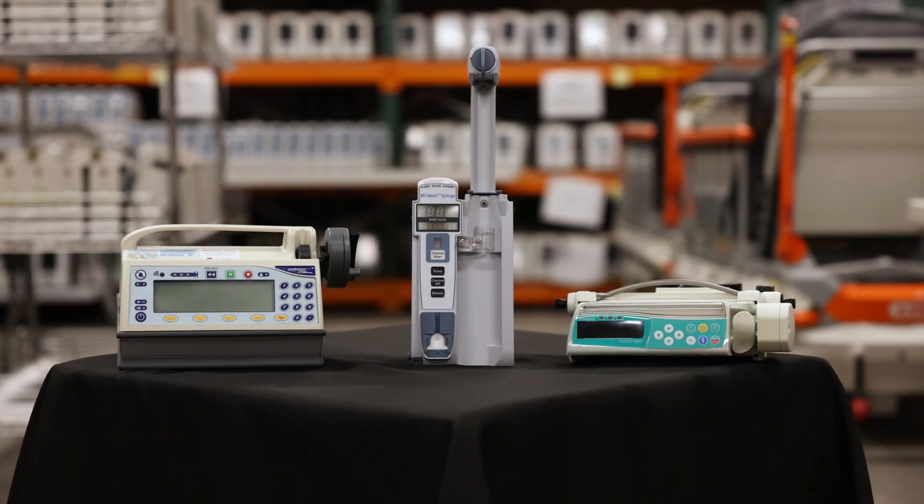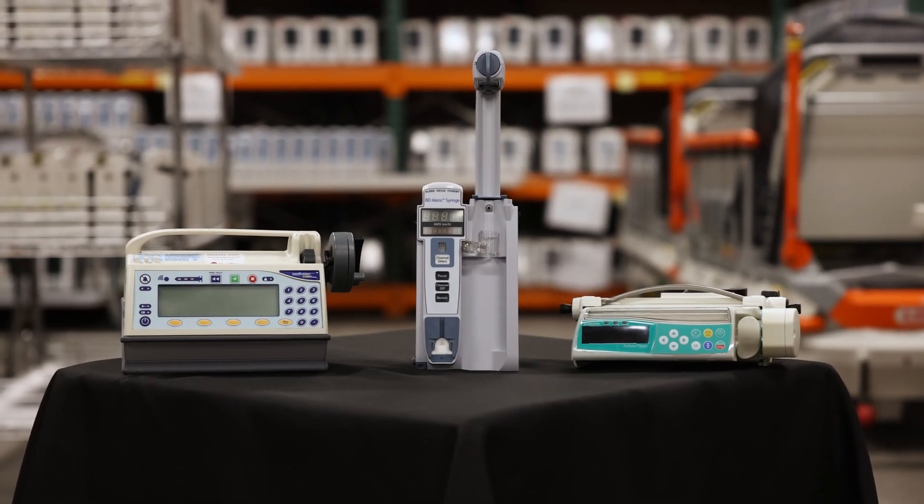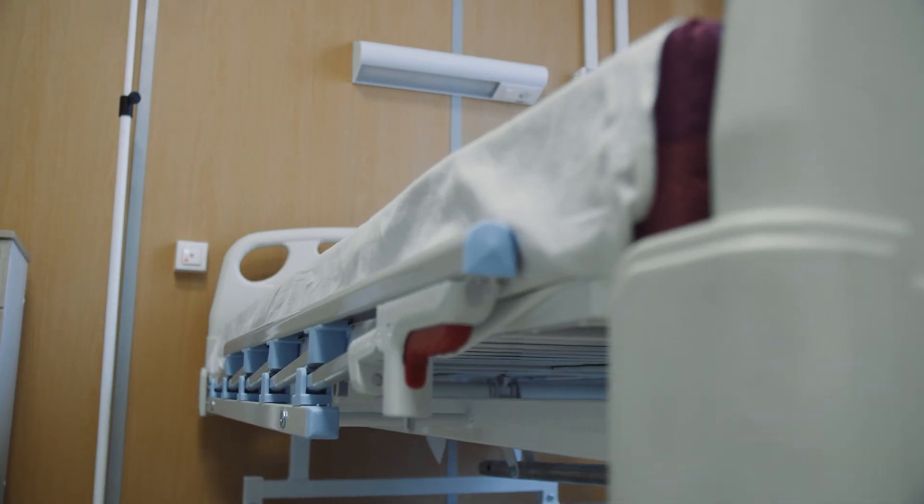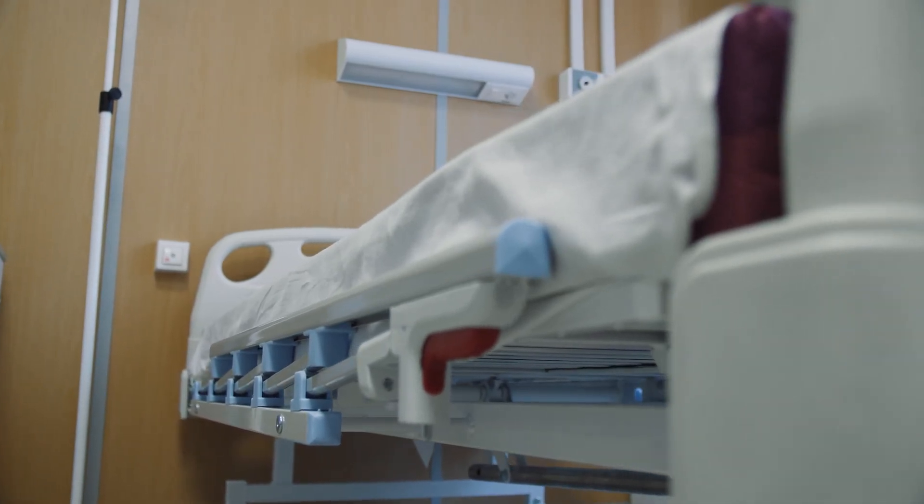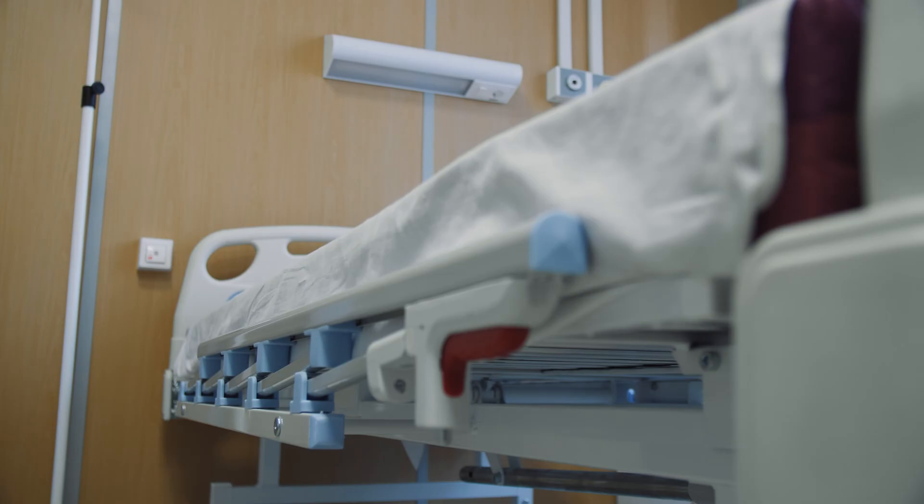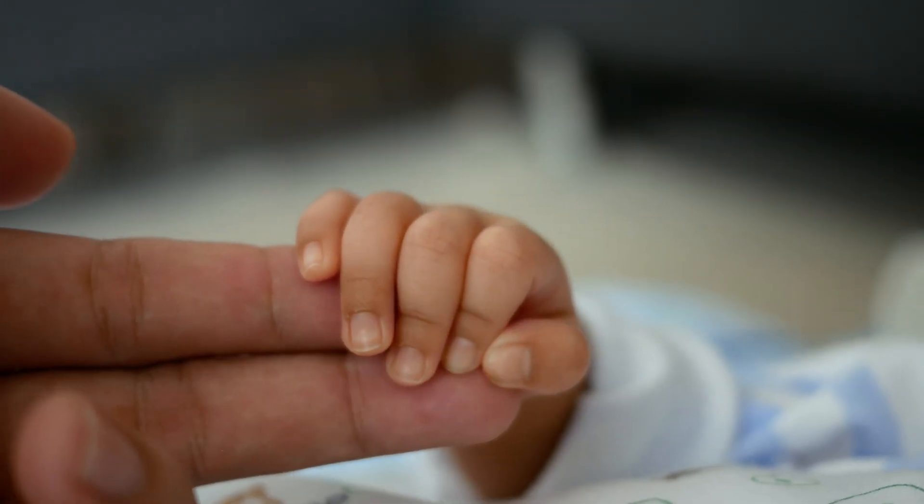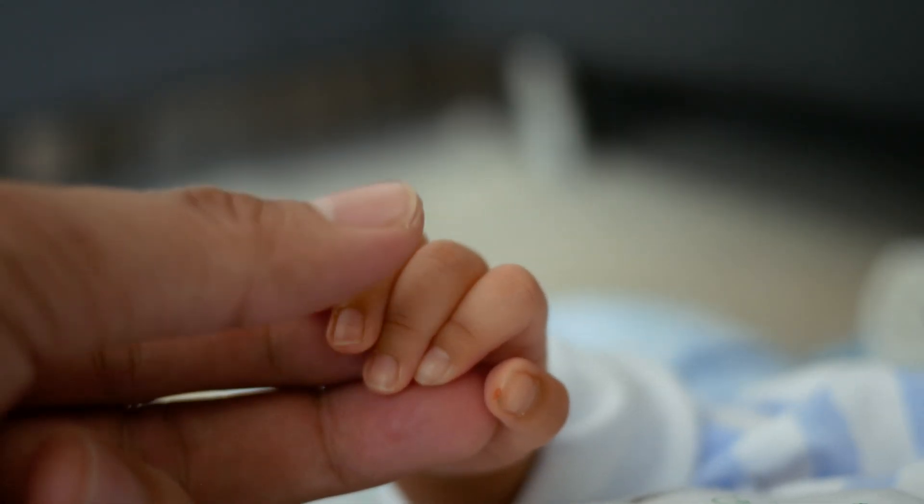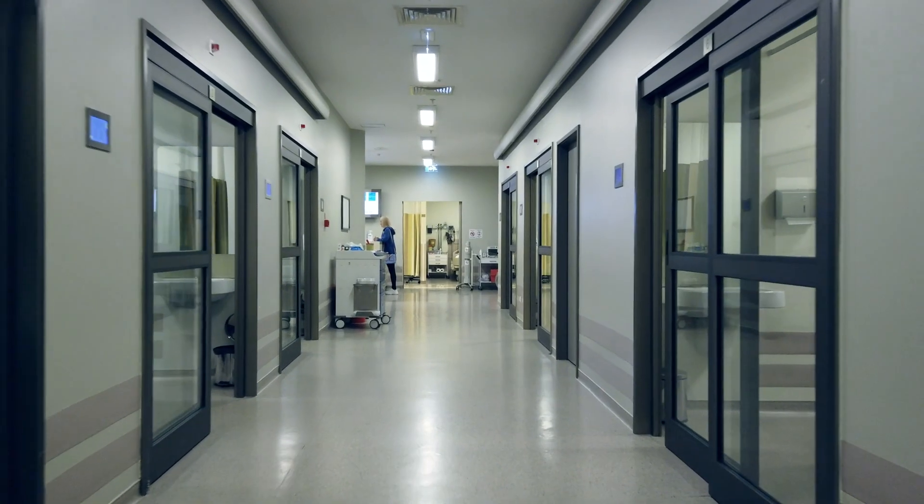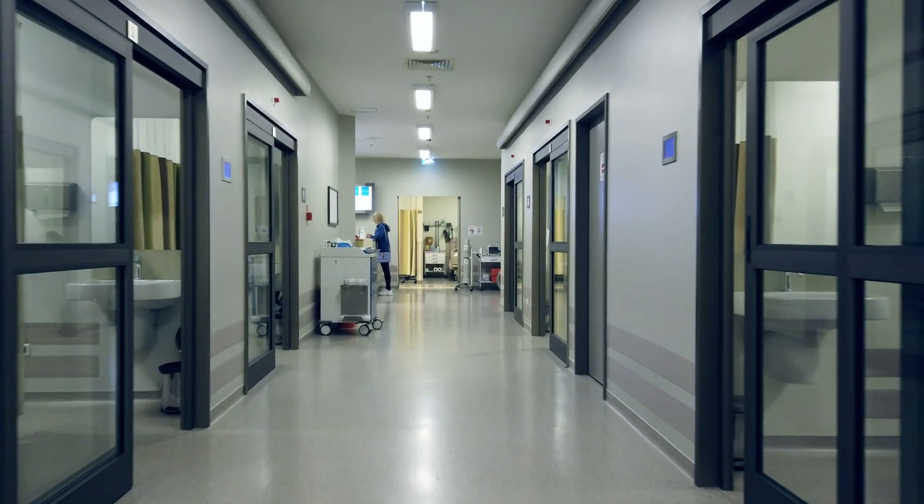Like large volume infusion pumps, syringe pumps are used in various healthcare settings. Syringe pumps are specifically used to deliver smaller, more precise amounts of medication to patients versus large volume infusion pumps intended for use in critical care, pediatric, neonatal, and other healthcare applications. We are going to take a look at some of the top syringe pump models that are on the market today.